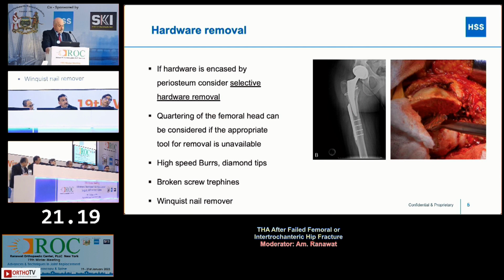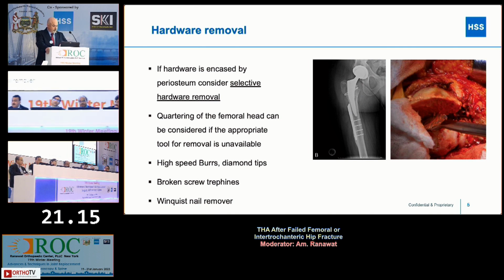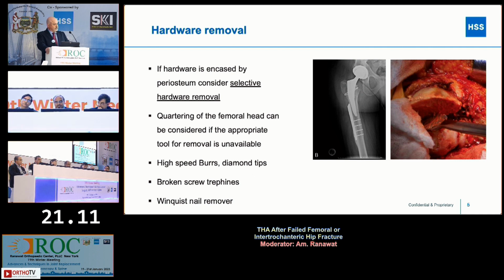It requires a lot of release. Fibrous tissues are stronger than the osteoporotic bones. When there's a failed internal fixation, these patients are not weight-bearing or it is painful, then the bone becomes osteoporotic, and there is a lot of release, proximal femoral release. That's why adequate blood and blood products have to be kept standby on the operating table.